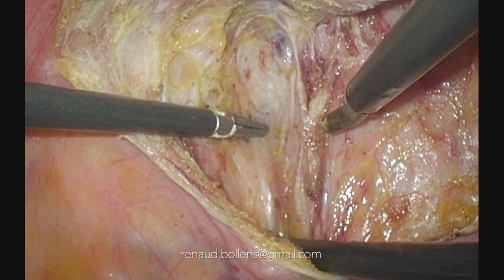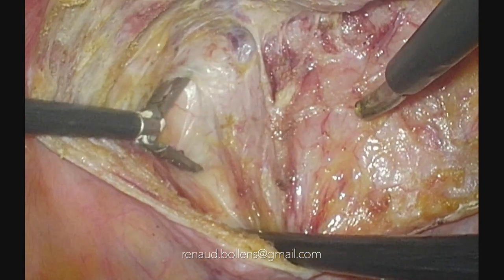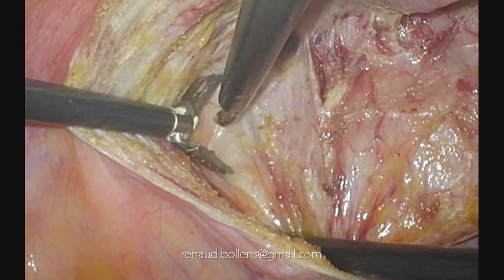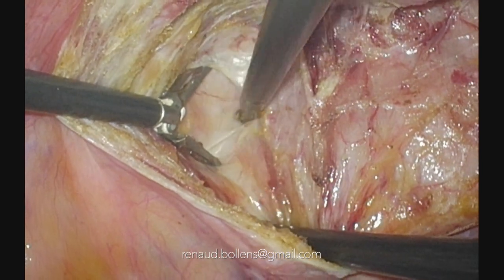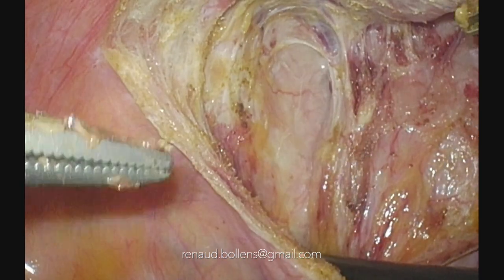I put my grasper. I open my grasper. It gives two directions of traction. I move back my grasper, three directions of traction. I come with the tip of my scissors and I push between four directions of traction. You see that I push one time, it's done.